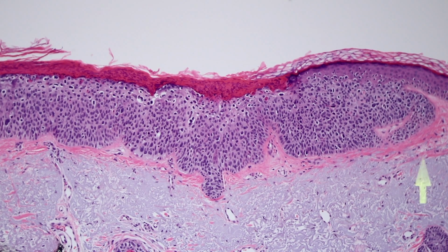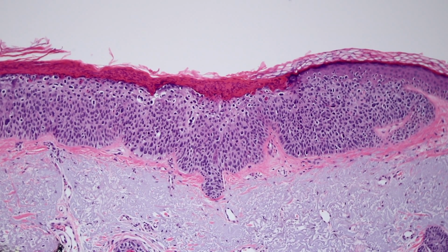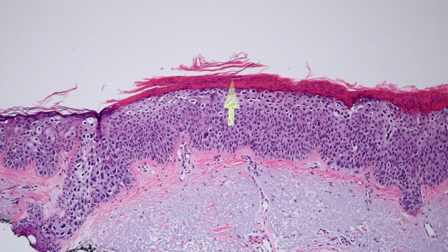So here though, you can tell this is full thickness atypia. There are atypical keratinocytes going from the top to the bottom. Sometimes it gets a little vacuolated artifact like this at the top. And the granular layer is usually lost in both AK and squam in situ. Usually the granular layer is diminished or lost, and then instead of orthokeratin, you have parakeratosis. But that's not always true, and we'll talk about that and show some exceptions a little later.